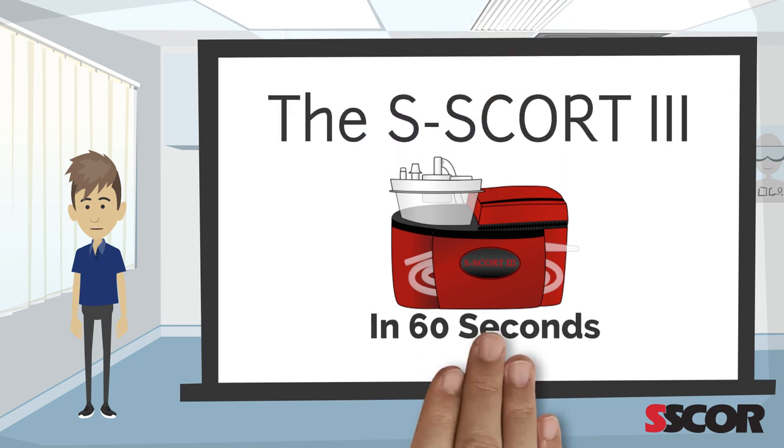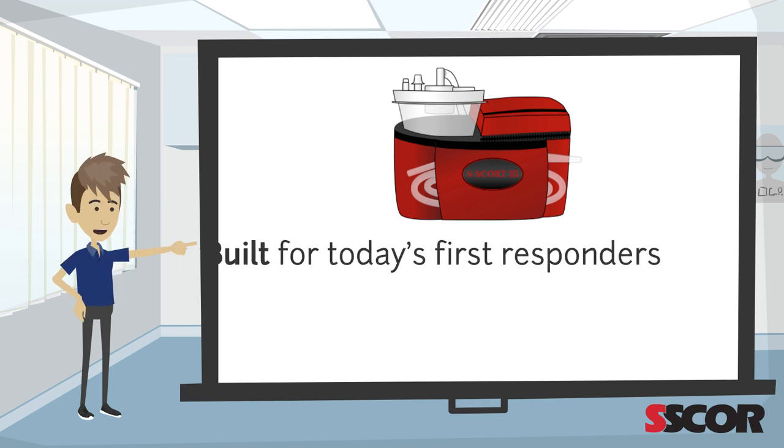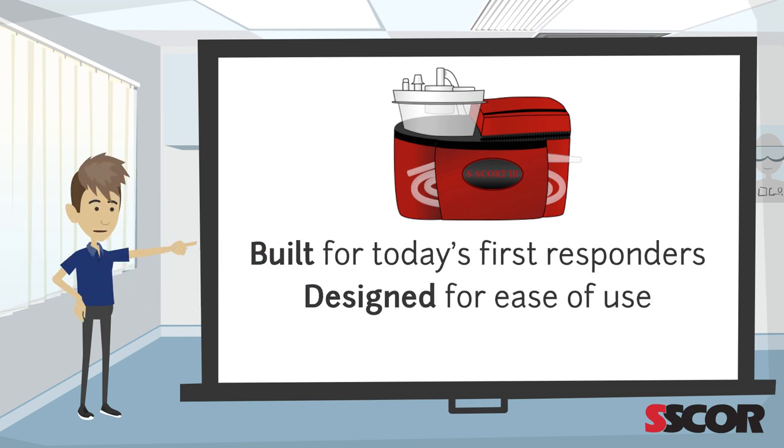Welcome to the Escort 3 in 60 seconds. The Escort 3 is built for today's first responders, designed for ease of use and engineered to last.